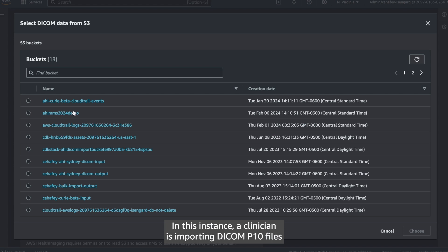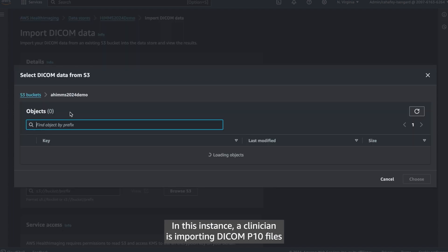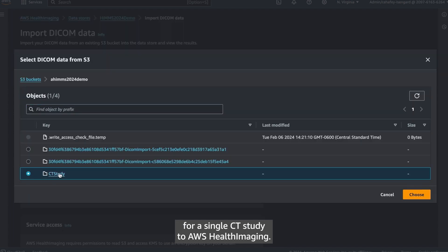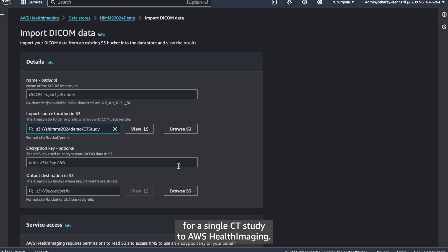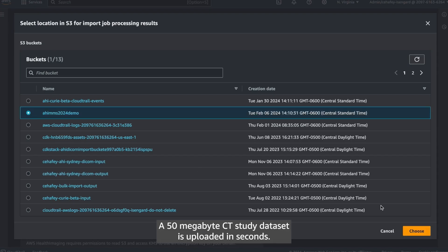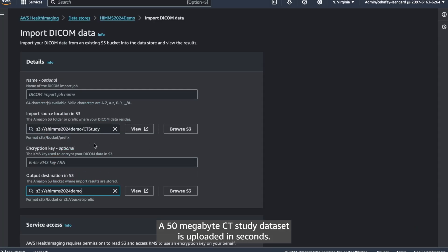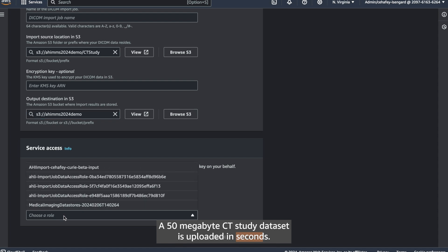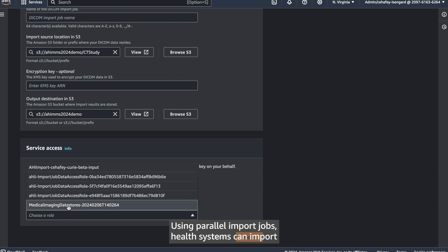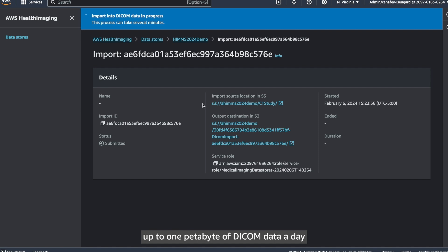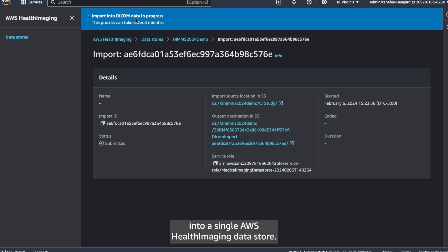In this instance, a clinician is importing DICOM P10 files for a single CT study to AWS Health Imaging. The import is rapid. A 50 megabyte CT study dataset is uploaded in seconds. Using parallel import jobs, health systems can import up to one petabyte of DICOM data a day into a single AWS Health Imaging data store.